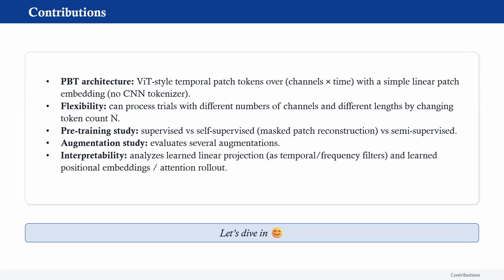Yes. So the more common way is to do a frequency transform on the data, and what that does is generate something called a spectrogram. That's also an image, yes. It's just an image that visually represents the frequency content of the EEG signal.